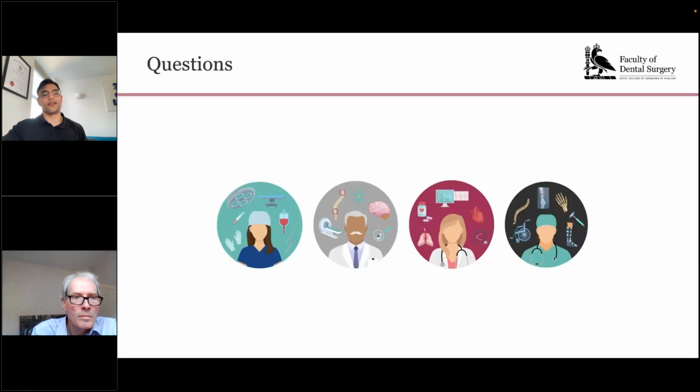Okay, thank you. I think we have a question from our very own Robert Crawford, FGS board member. What are your thoughts on using buccal mirrors? Yeah, I think again, buccal mirrors give you the best perception, the best idea of what the buccal occlusion is, all the way to the last standing molar. I was having a discussion about this just today, actually. I think that's the gold standard, isn't it?